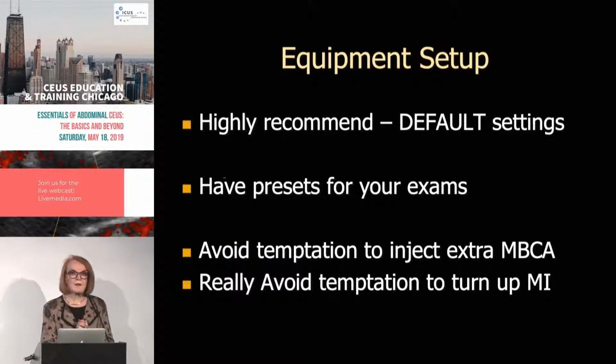And so one of the things that I always try to stress when I'm talking to the vendors is that I want to recommend to people like you, as you did, Richard, that we use the default settings. In other words, when we turn the machine on and we go to what you recommend we use with your machine, I want that to work, and it does usually.